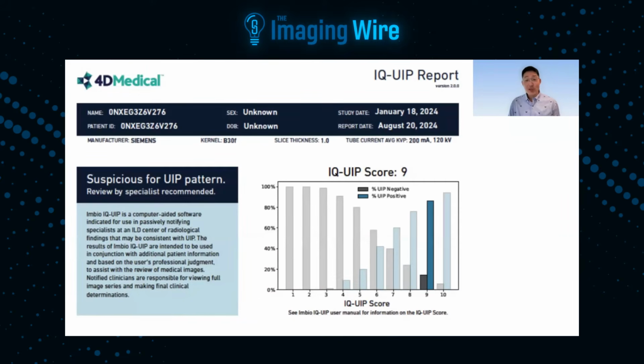It's really, really good. The really exciting thing is if you compare it to any one of these chest radiologists. Remember, there were 5 radiologists, and I was one of them. I was one of these, quote unquote, expert readers. Compared with any one of these 5 radiologists, it performs quite similarly to 3 of them, but for 2 of the radiologists it actually performed a little bit better.